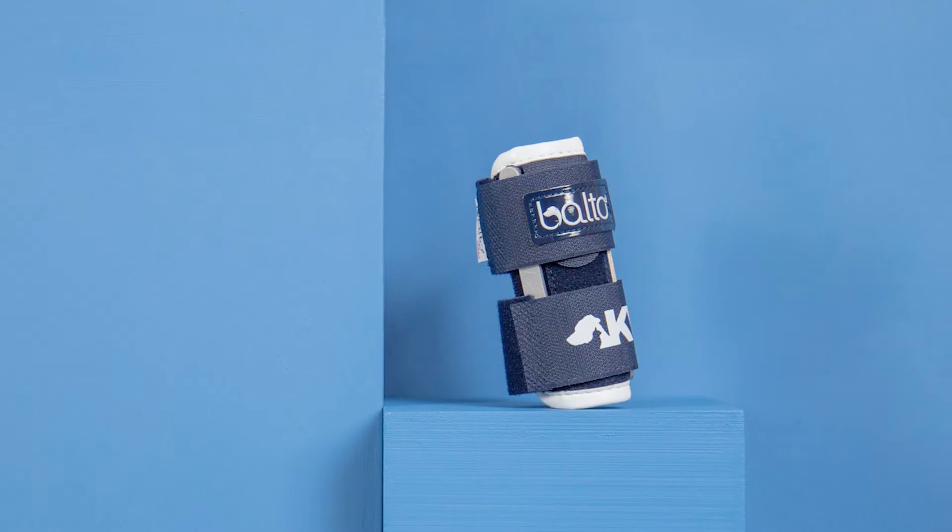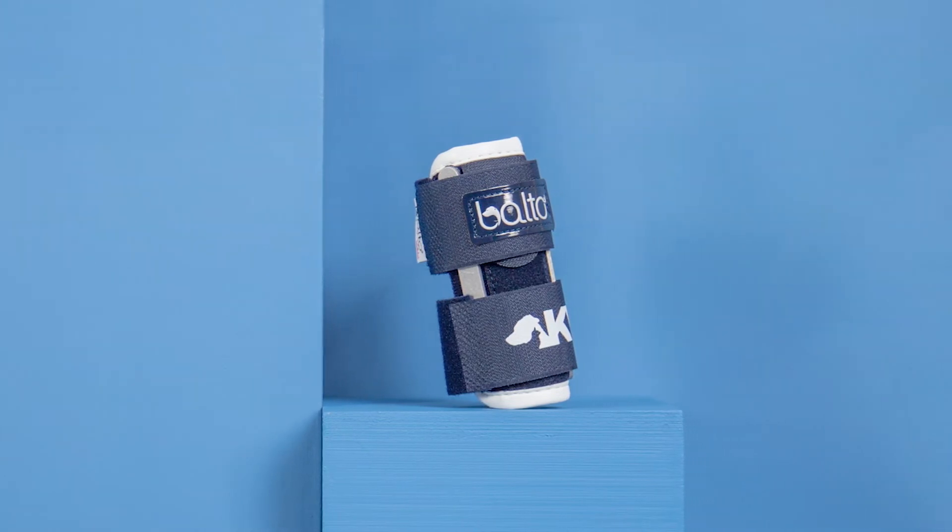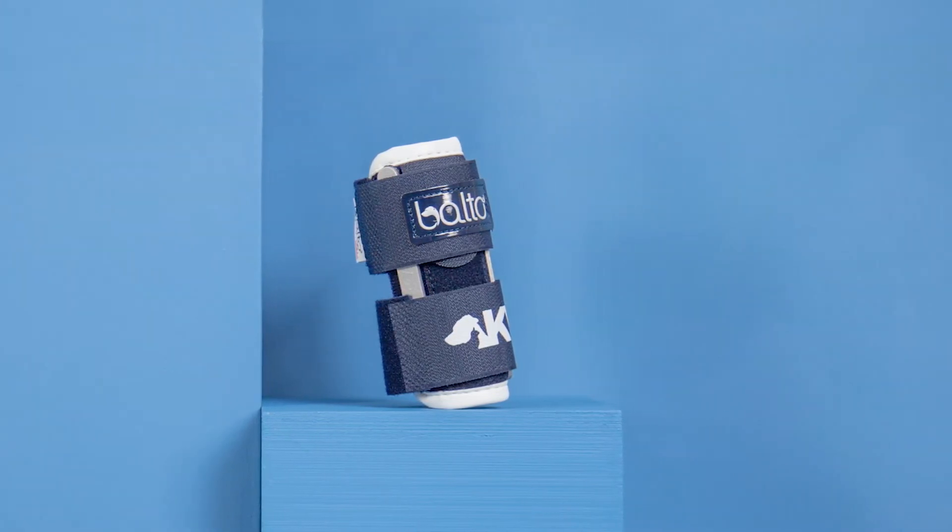This brace consists of three adjustable aluminum splints that help to stabilize the affected area, similar to how a splint or a cast would. The Balto Bone is also an ideal brace to have stored in any veterinary setting for a quick stabilization of the radius, ulna, or carpus when an emergency has occurred.